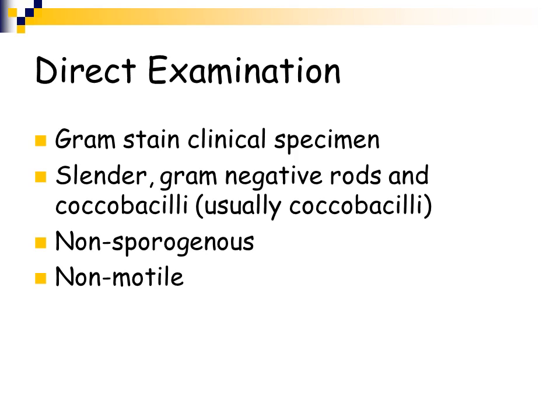So, one way to identify Haemophilus is through direct examination. And we mentioned direct examination in previous lectures. That is when you look directly at a clinical specimen. In other words, you don't rely on growing the clinical specimen on agar medium or in a broth. You take that clinical specimen, usually put it onto a slide, depending on what specimen it is, and then you gram stain it and look for the organisms directly in the clinical specimen.